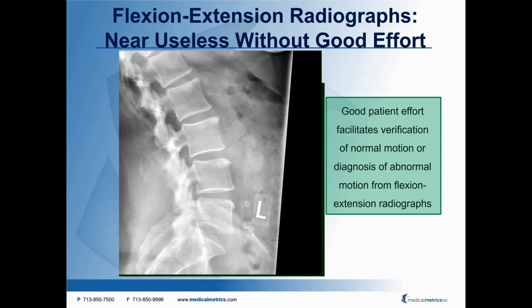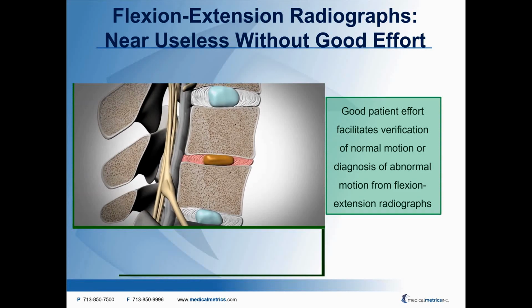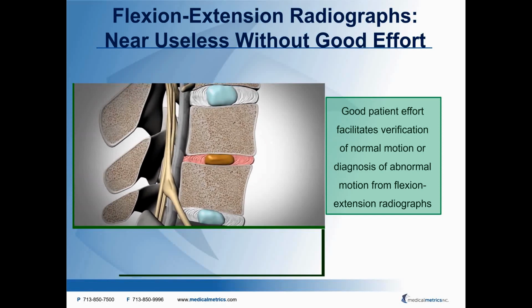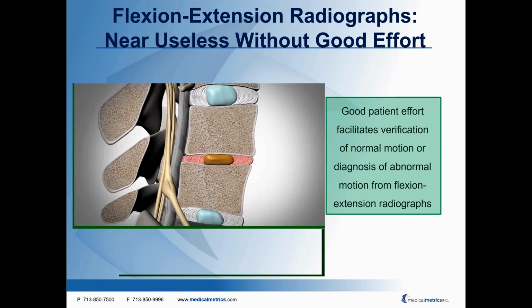In contrast, this is a flexion-extension study with good motion. This flexion-extension exam can be used to assess the intervertebral motion restraints. With sufficient patient effort, a simple flexion-extension exam can be used to diagnose when intervertebral motion restraints fail to maintain motion within normal limits.